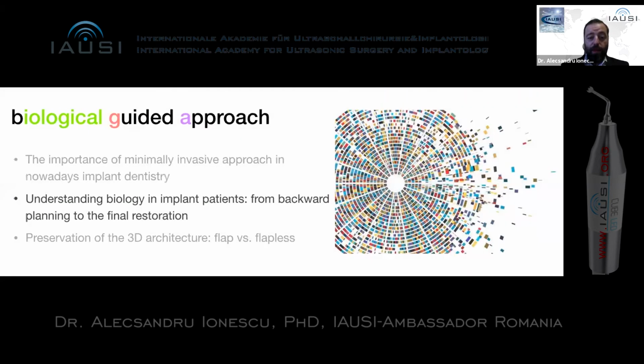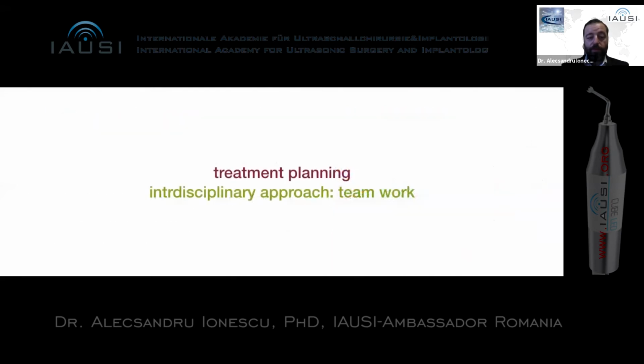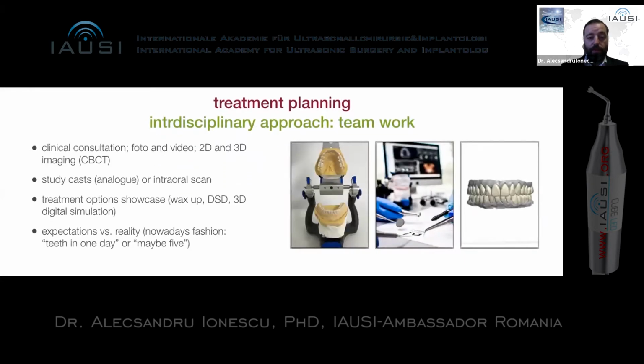Now, a little bit about patient planning, from backward planning to the final restoration. We always do this work interdisciplinary, and we try to have the final result in mind from the beginning. We have a dedicated session for initial consultation where we do the pictures, 2D and 3D imaging, intraoral scan.